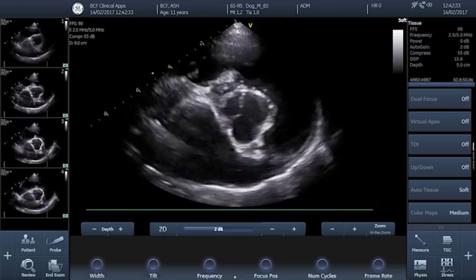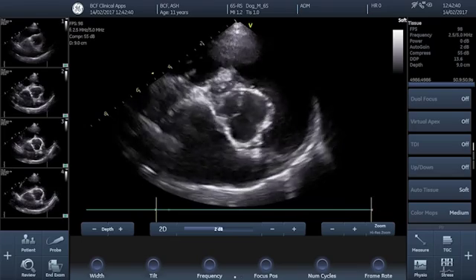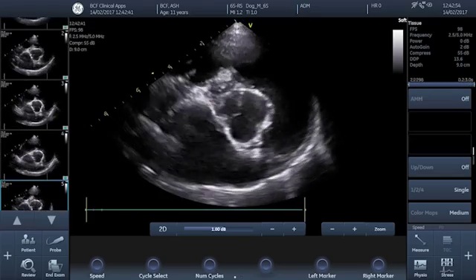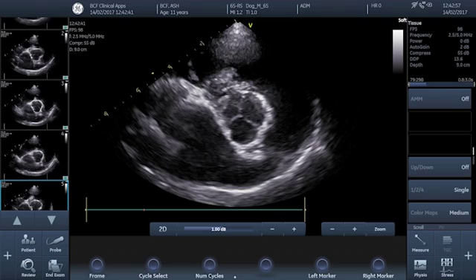Once you're happy that you have the view optimised, allow several cardiac cycles to pass and then store a cine loop. In practice you'll go through acquiring all of the cine loops you need in the different views for the various measurements you want to make, and then you can go back and make the measurements later at your leisure rather than trying to do it while scanning the animal. For the purposes of this video we're just going to store a cine loop and then move straight on to making the measurement.